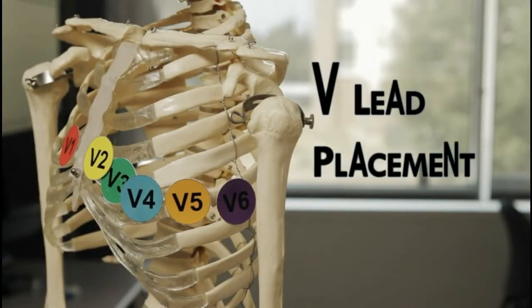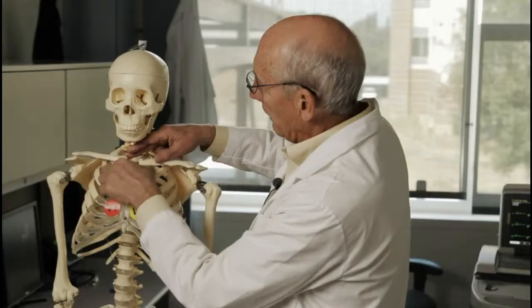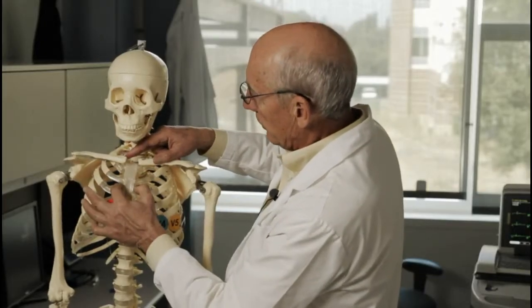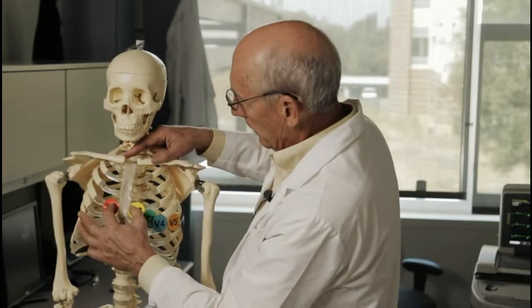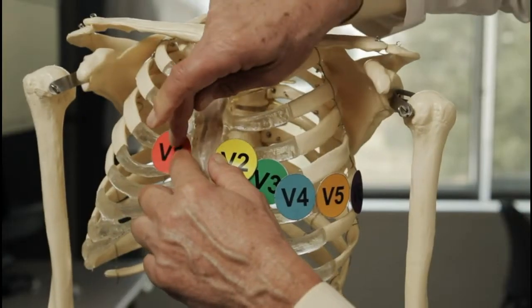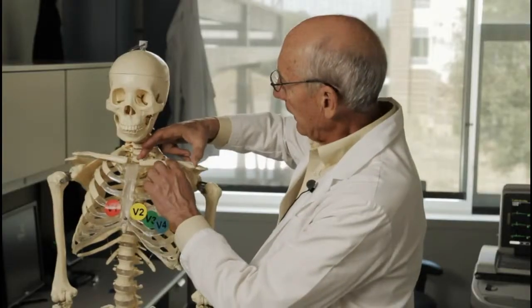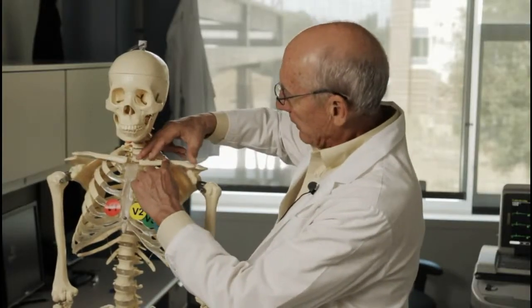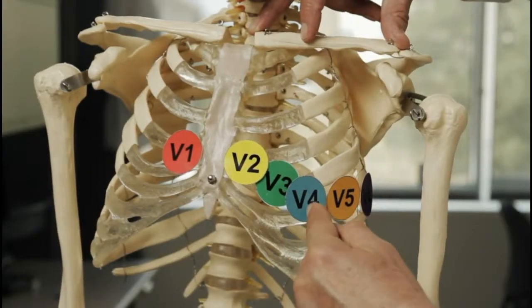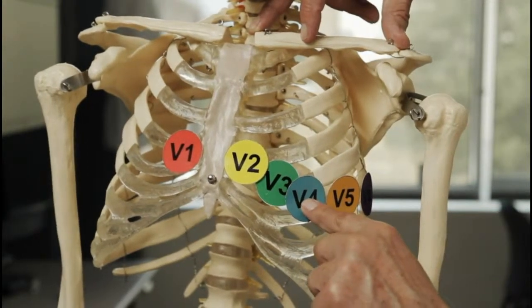Let's move on to the chest or V-lead placement. This can be a bit more difficult than the limb leads. We first find the clavicle and the sternum and go under the clavicle to find the first, second, third, and fourth intercostal space. V1 and V2 are exactly on either side of the sternum in the fourth intercostal space. The next important landmark is to find the clavicle, go to the midpoint of the clavicle, go in a straight line down to the fifth intercostal space — that's the placement for the V4 electrode.